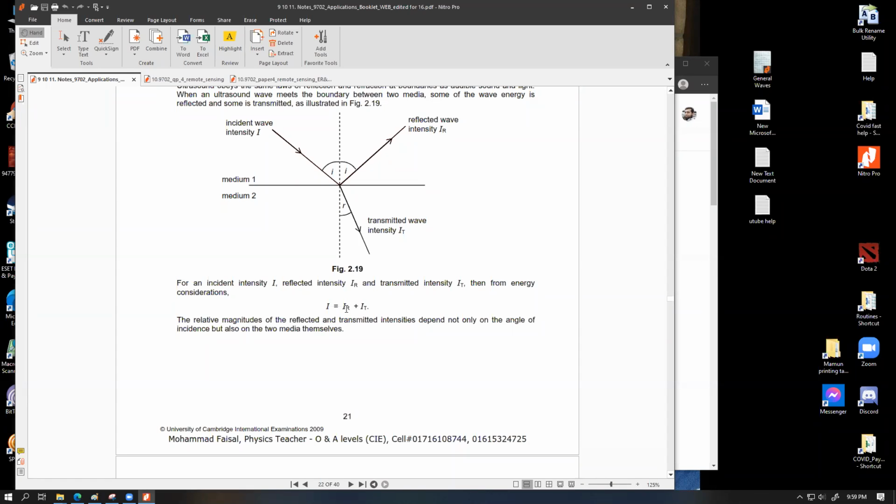So it basically works like a thicker human skin, but it does not actually reflect much whenever the sound travels from that gel into the skin, because they both pretty much have the same acoustic impedance, which means R is nearly zero, which means most of the part is transmitted, which means a significant stronger signal enters into the body.